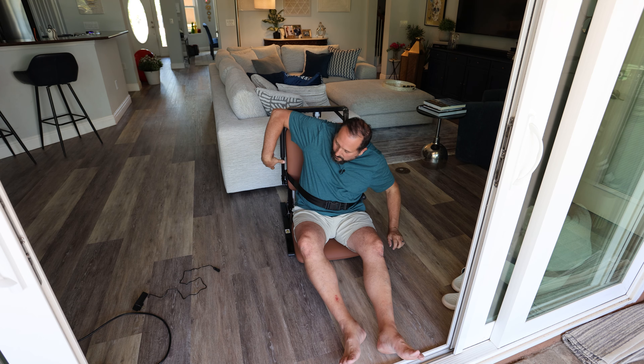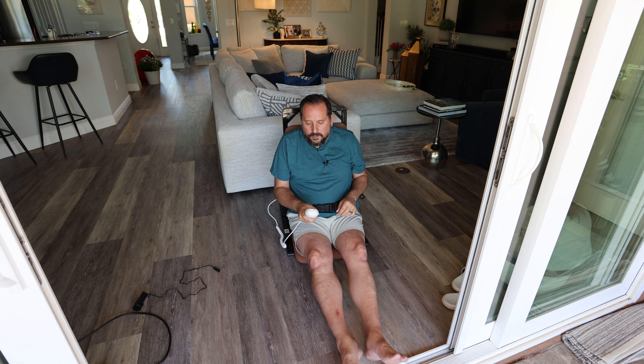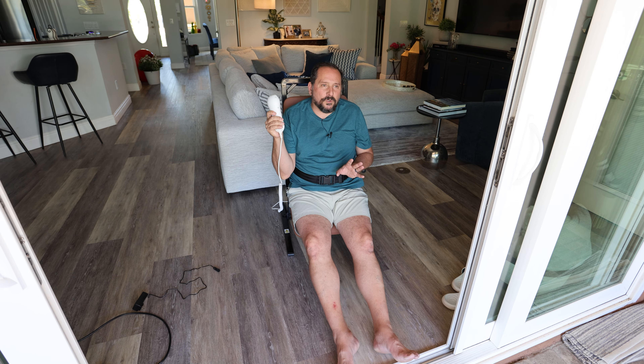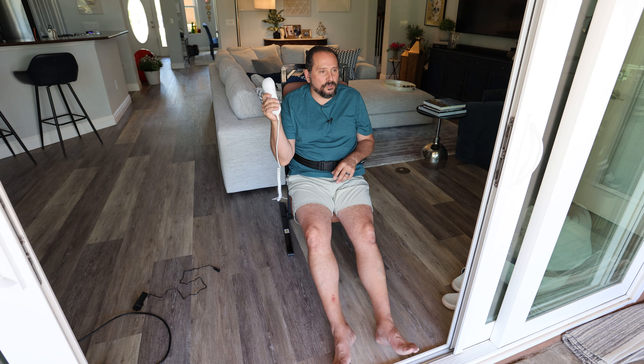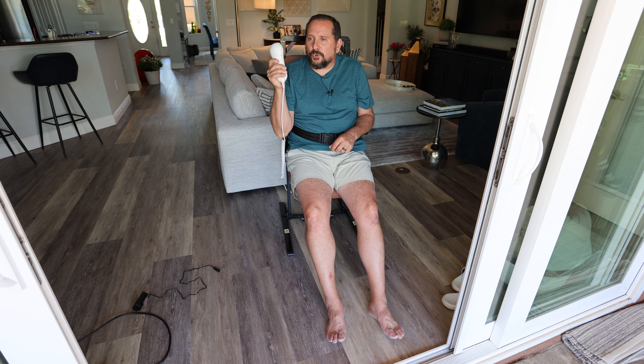Going up — next stop, 22 inches. I think it's giving me an audible tone as you get towards the top. Every once in a while I open something up and think, how can this be so simple and easy and resolve such a major problem in people's lives? I hope this was helpful — this was really enlightening for me. I don't think my head's in the shot anymore, it's so high up — you're just watching my seat go up.